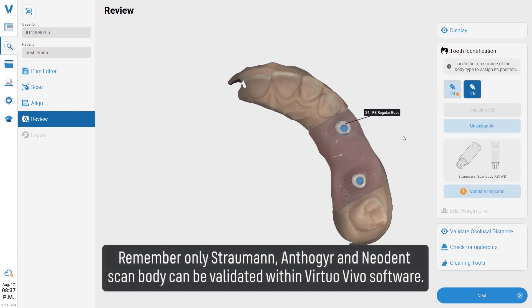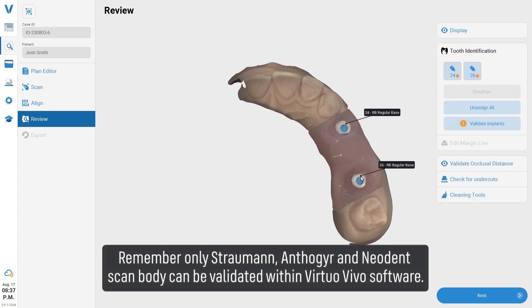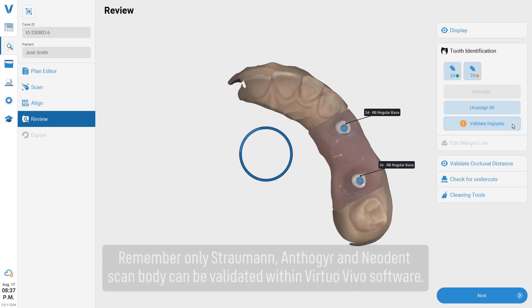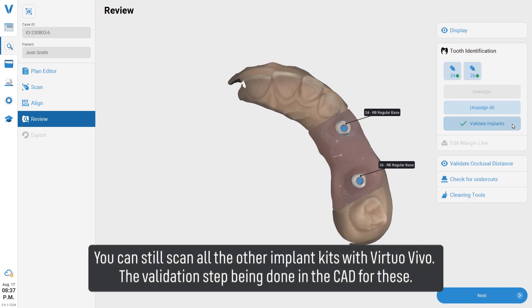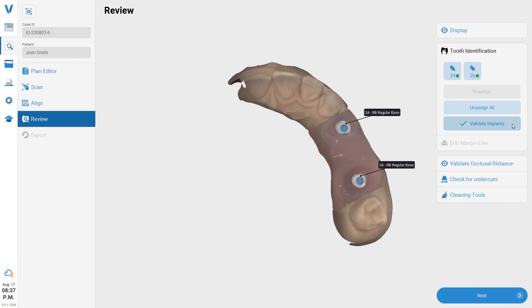Select the Tooth Number tab and click on the top flat surface of the scan body. Remember, only Straumann, Anthogyr, and Neodent scan bodies can be validated within Virtual Vivo software. You can still scan all other implant kits with Virtual Vivo, but the validation step is done in the CAD for those.